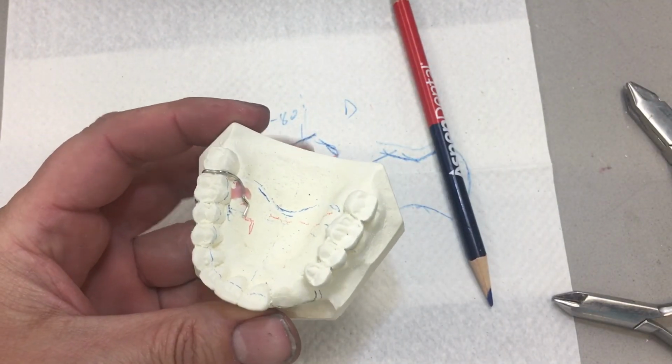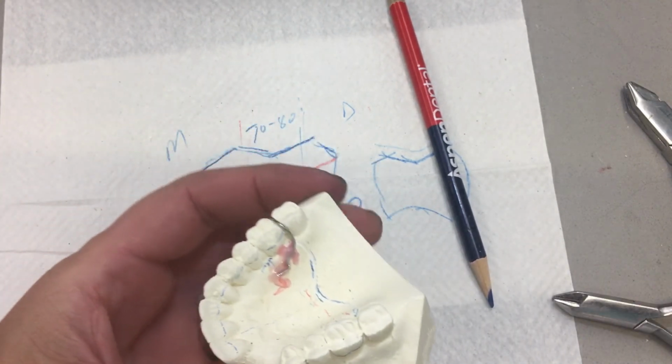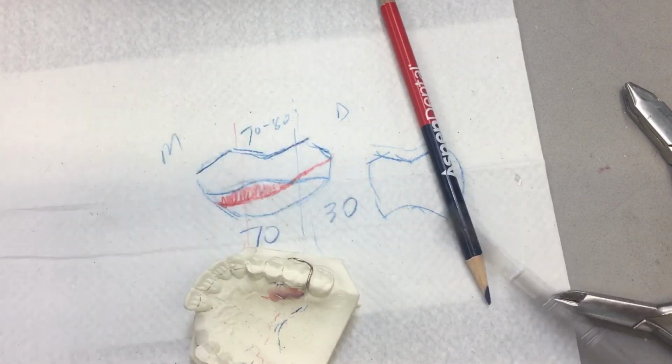Oh yeah, 0.9 wire. And just wax on the end here when you're done. What size of wire are we using? 0.9. Excellent question.